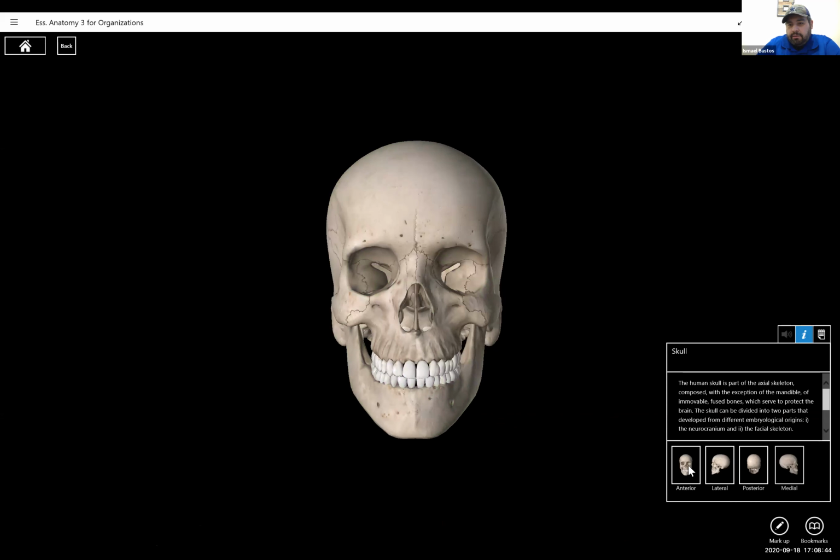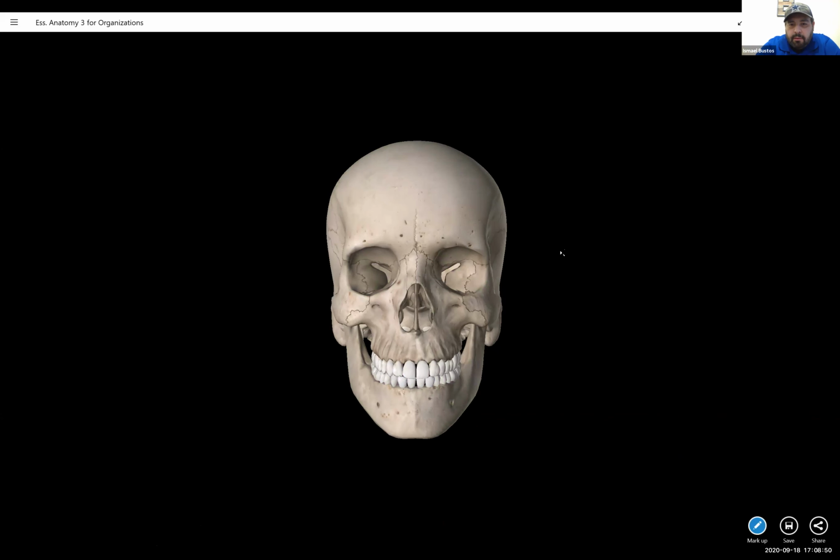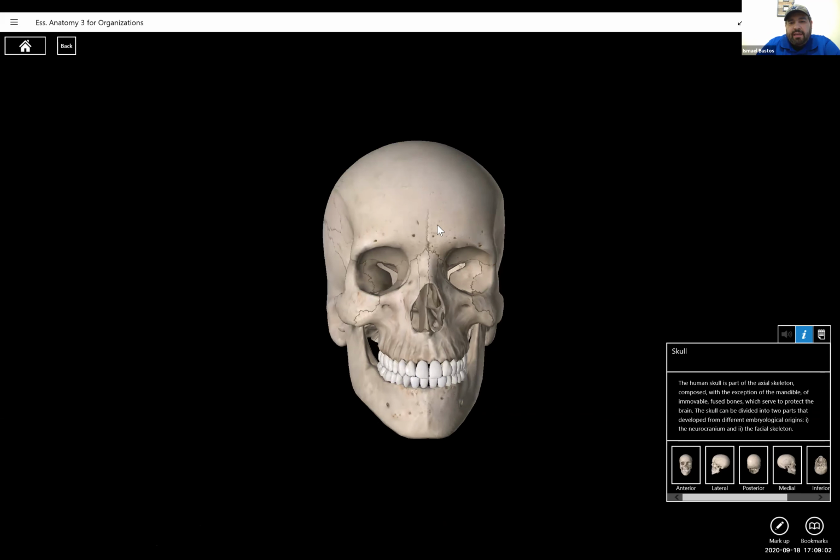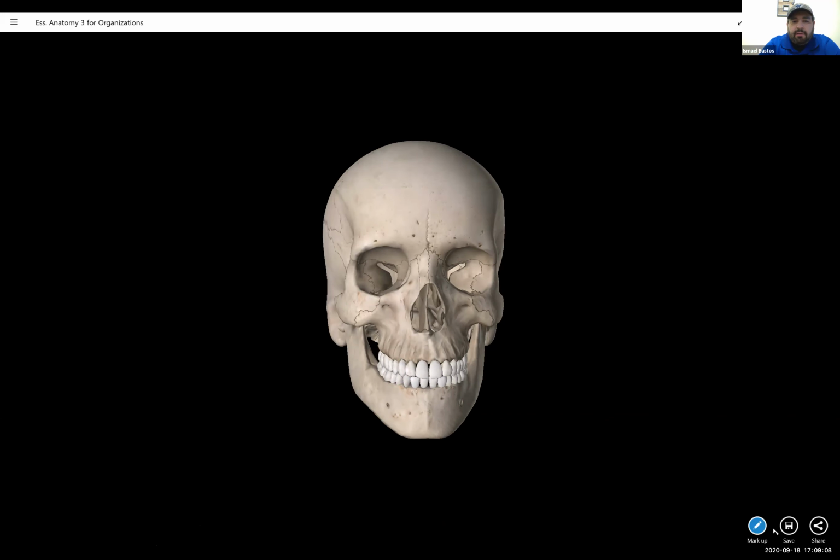We're going to look at just the frontal view there. So it's perfectly straight. What we're looking at is the distance between there and there, right? They're the same on both sides, no rotation. However, if one side is rotated more, what happens to that side? The distance between the cranial cortex and the lateral margin: this side gets bigger, this side gets smaller.